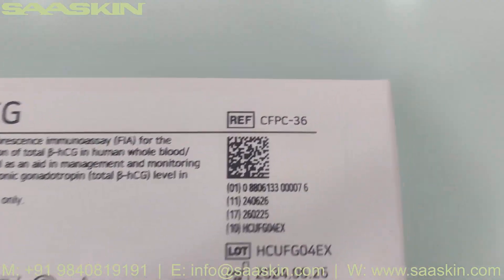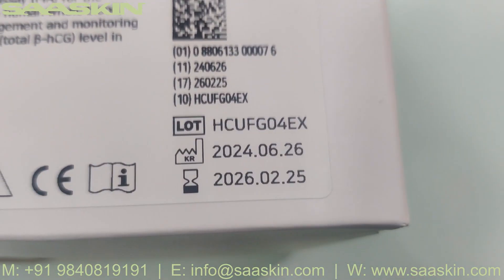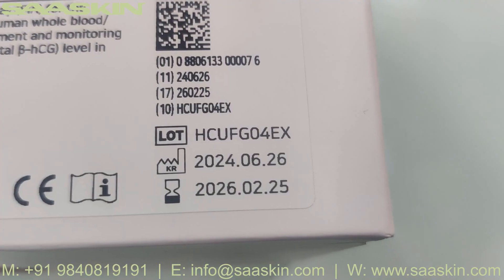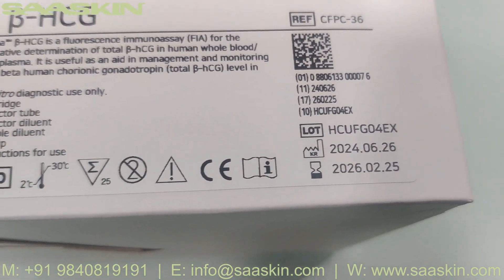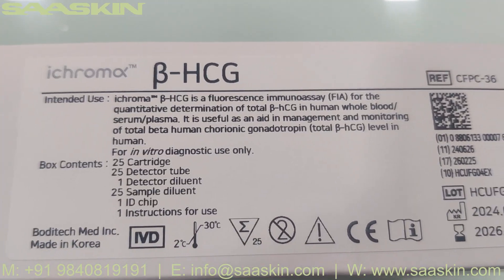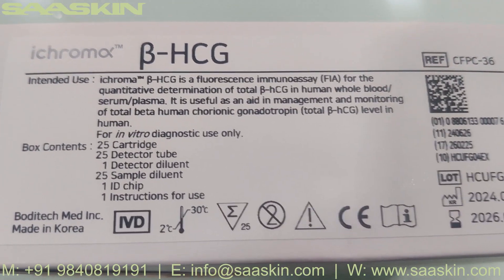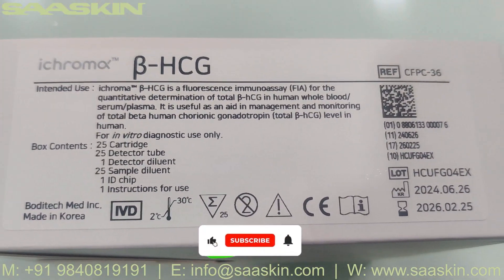You can see this here — the reference part number is CFPC-36. You can see the lot number, manufacturing date, and expiry date is given. This is the iChroma Beta HCG. This is a 25 test kit pack, it is CIFD certified, and it can be stored at room temperature.